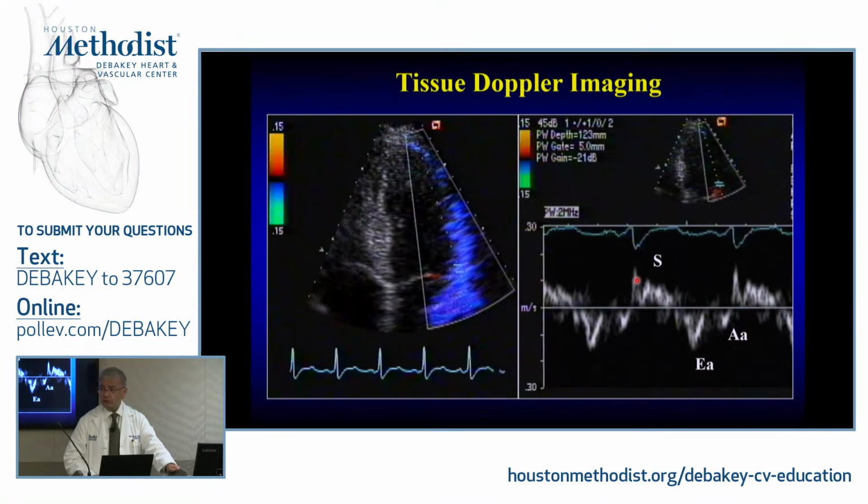Tissue Doppler we're using a lot, thanks to many investigators, including Dr. Nagueh, who was actually the first to look at this from a diastology point of view and predicting of pressure many, many years ago, 1997. You got it?